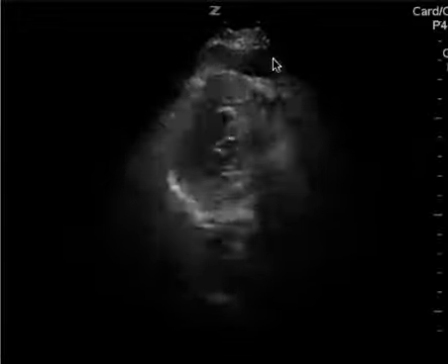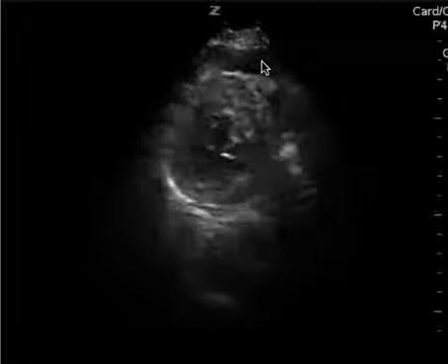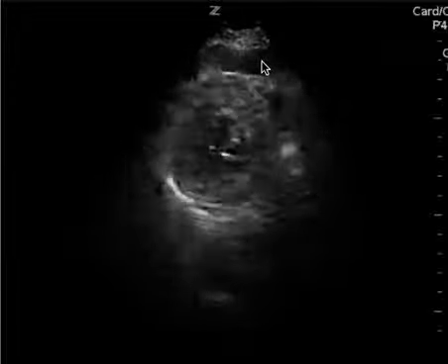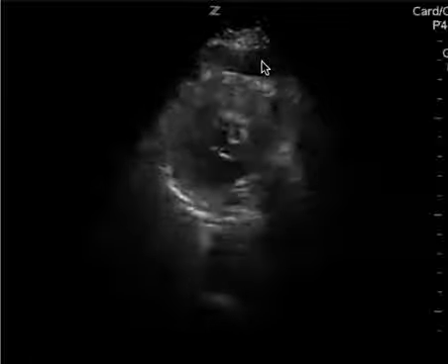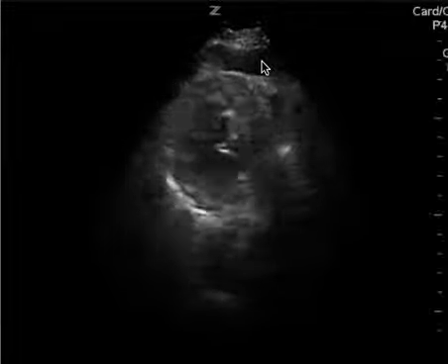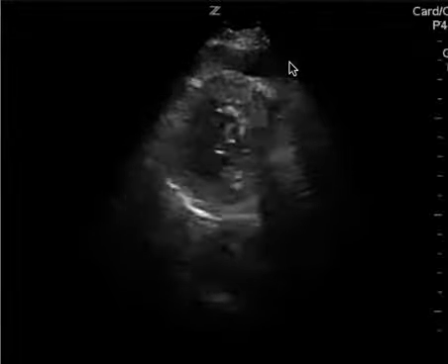Again, you see that anechoic finding here that to me, if I had to guess, is a pericardial effusion. But I wanted to make this video just to illustrate that I think it's a limited study — I don't think you could safely say that there is or is not a pericardial effusion. If I had to guess, I would say it is a pericardial effusion, but it's tricky just based on this view and this view here.